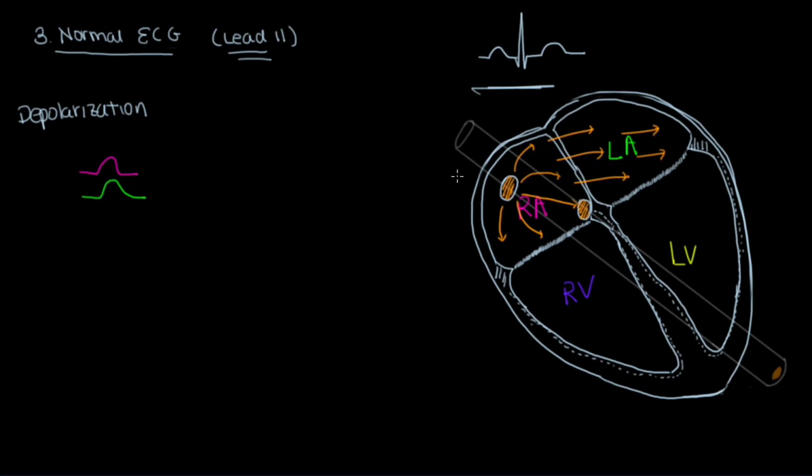Lead 2 is kind of oriented this way, right? So the overall signal is kind of downwards, or whatever this lead is able to see is only charges that go directly in this direction, right? So in terms of that, if you were to say the charges are overall going towards the sensor or away, it's going towards it, right?